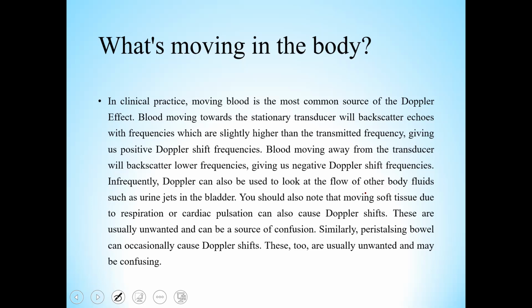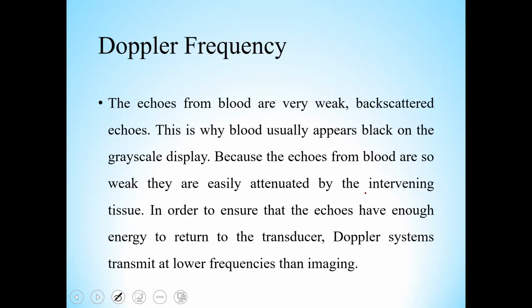Apart from that, some other fluids can also be detected with the help of Doppler, for example urine jet and the urinary bladder and so on. But most commonly, RBCs, blood, could be detected with the help of Doppler.